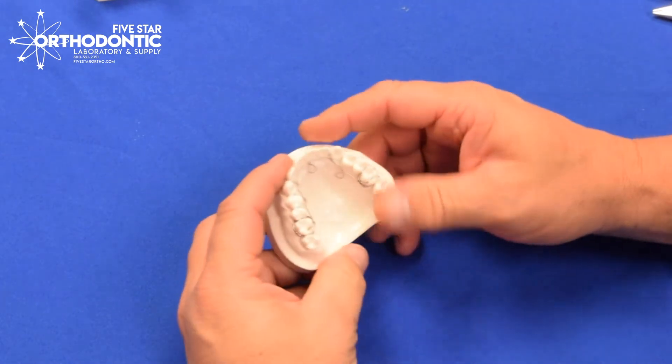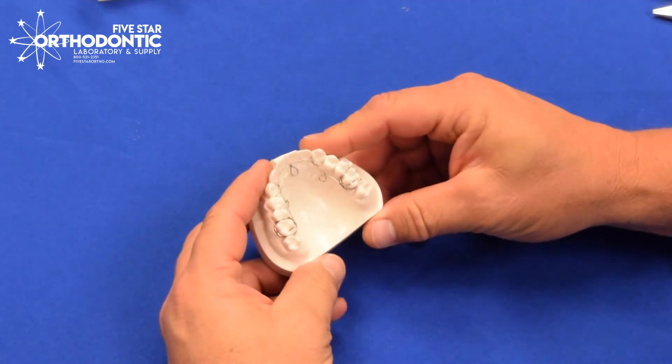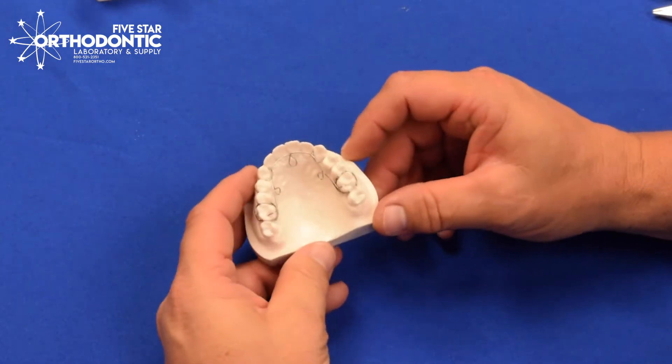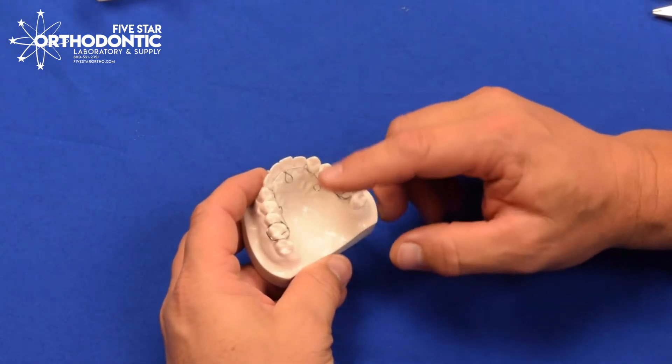Adjustment of an ALF. The ALF appliance is a light wire functional that will do expansion, usually used in adults. It has three omega loops — that's a standard ALF. You can do an anterior sagittal ALF that has two extra loops in this area, but this is the most common.